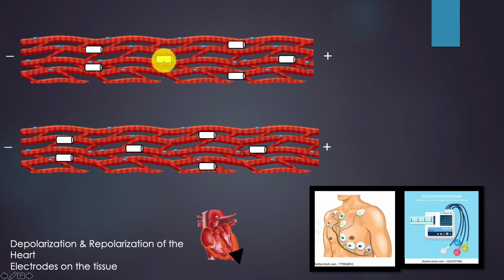And these little tubes, these little tunnels per se, are going to be really important when we have an action potential and when we have depolarization and we have positive charge flooding into this tissue or into these cells, right? So we're going to talk about electrodes a little bit, and this is introducing you to how the ECG machine shows these deflections that determine how the heart is functioning, because this is remarkable science.